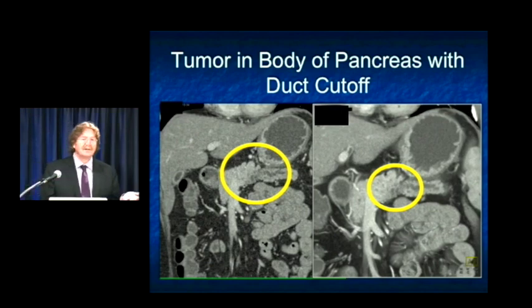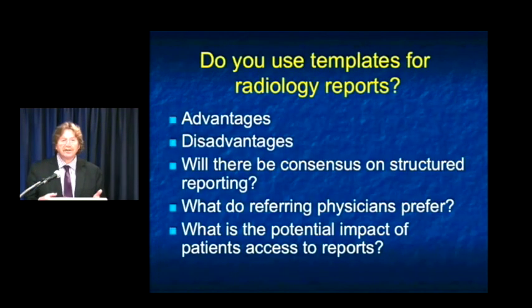What about using templates? The question, should we use templates, is indeed a very good question. I mentioned before, perhaps referring physicians will like templates. There have been several articles that suggest they do. So it will be something that perhaps will be one of the changes. So not only will we be looking at images differently, but how we report them will be different.